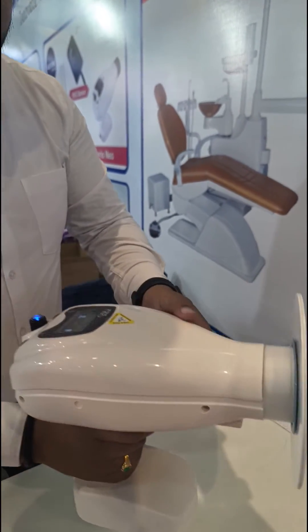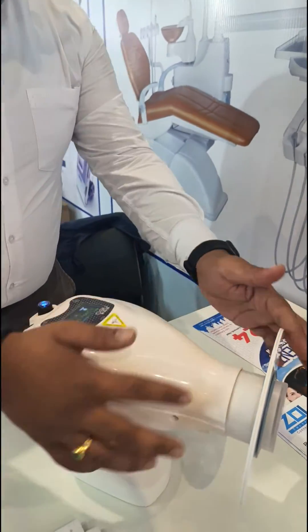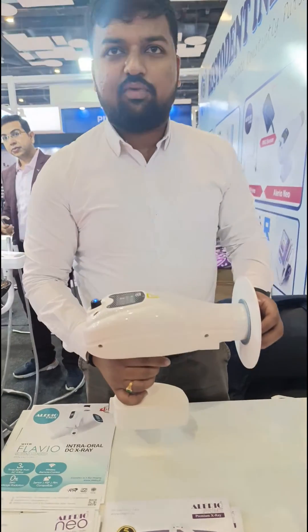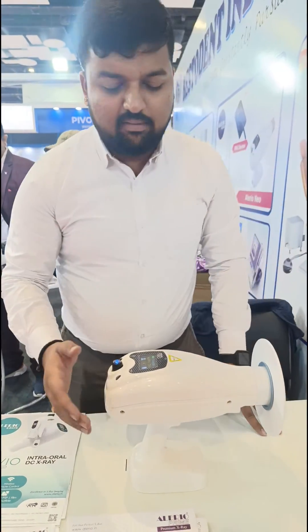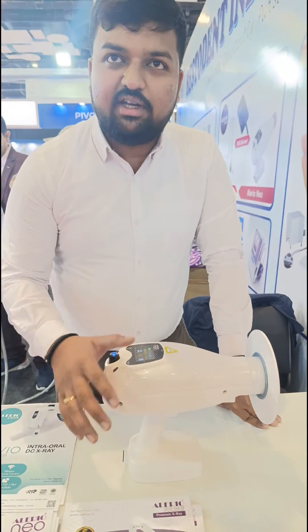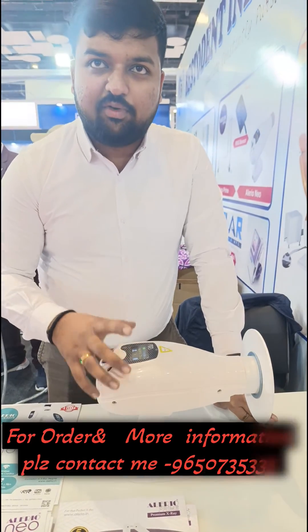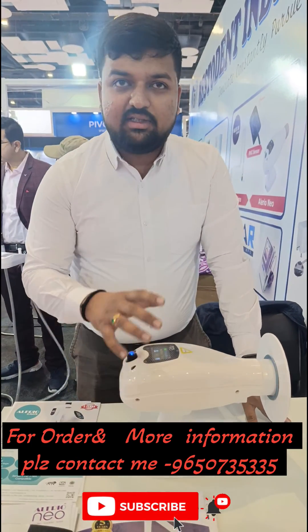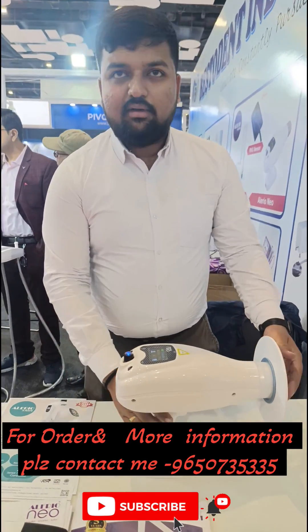For extra protection, we provide a lead scattering shield where radiation is controlled within 8 feet for the user — this is the biggest advantage of this unit. This unit comes with a seven-year warranty: the battery is included for the first three years, and excluded from the fourth year onward. This is the only X-ray with a seven-year warranty in India. We are the manufacturers and provide service all over India at economical cost, with no service charges.